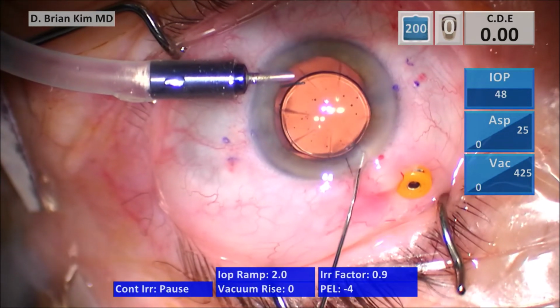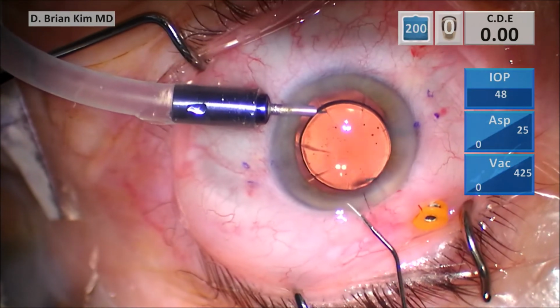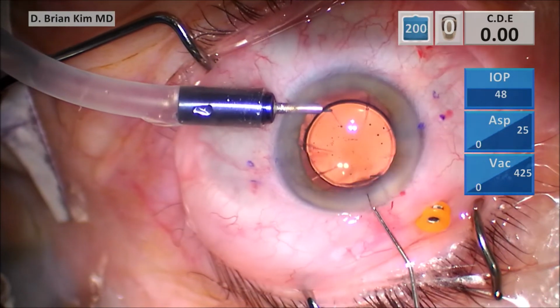Go ahead and seal my incisions now. Again, you can see a perfectly well-centered lens. Again, this patient's had RK, so of course we did the RK calculation as well for this patient.